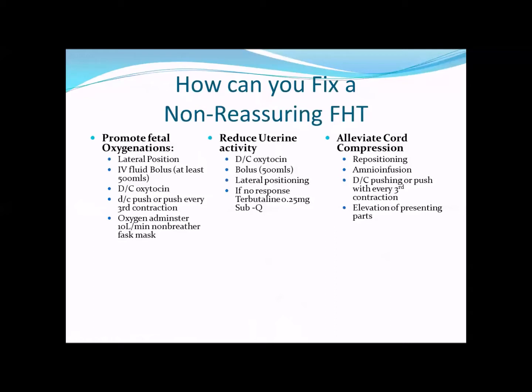So we may do an amnio infusion on that mama. Again, if mom is at the pushing, we're going to start letting that baby get a break. We're going to let that baby recover. And then we're going to elevate. So this is where the nurse comes in. If we see those nasty, yucky variables that the baby's not responding, we may have a prolapse cord.